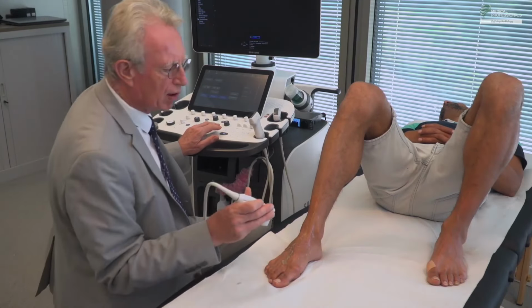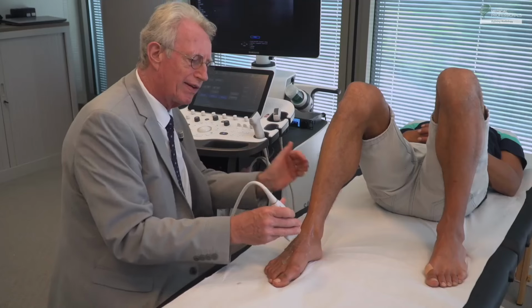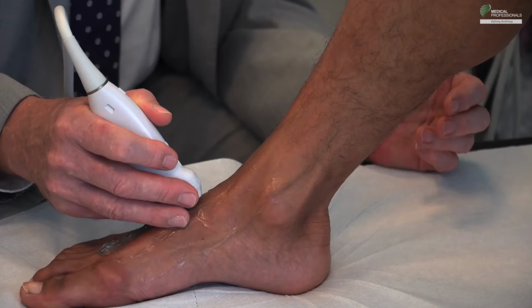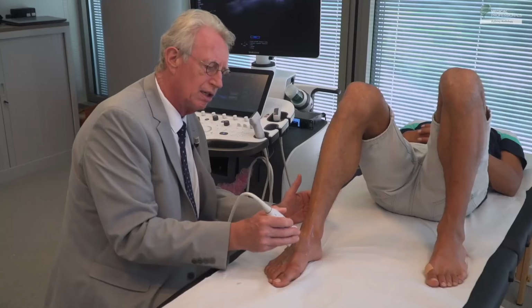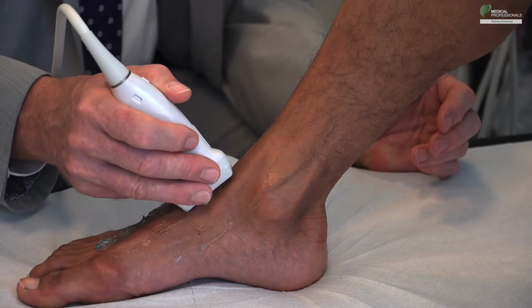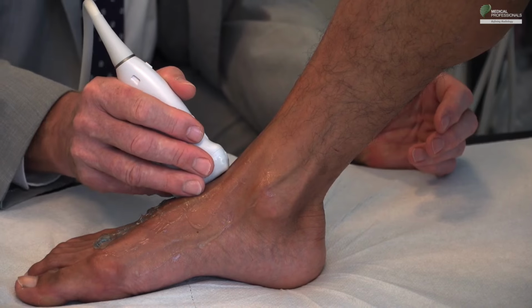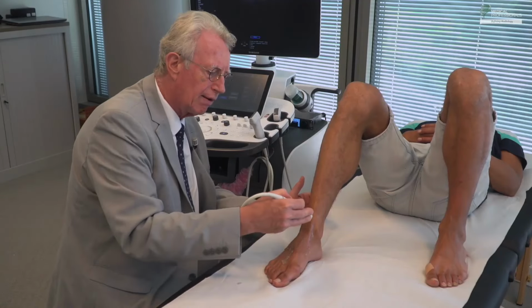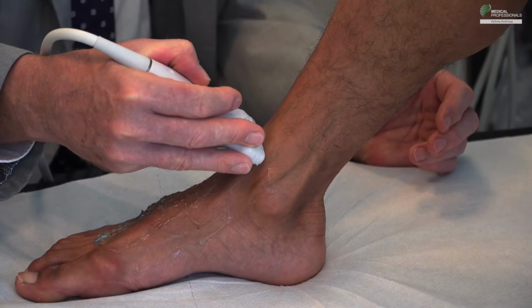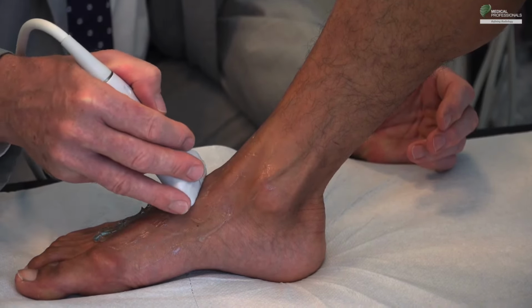So on the dorsal side, there first is the articular plane with the talocrural articulation and with the transverse tarsal and mediotarsal articulations. Then there are the tendons, the anterior tibial tendon, the extensor hallucis longus tendon, and the extensor digitorum longus. Then there are the two retinacula, the superior extensor retinaculum and the inferior extensor retinaculum, which is reflected around the extensor digitorum longus before dipping into the sinus tarsi.